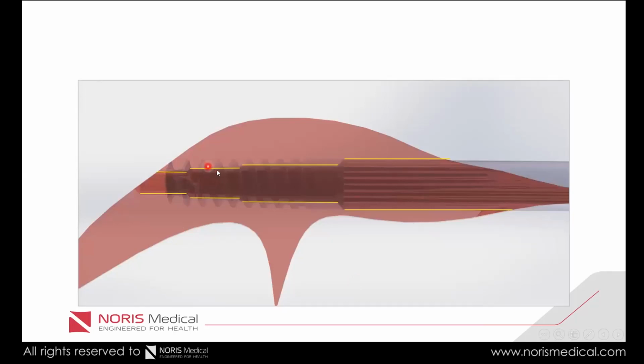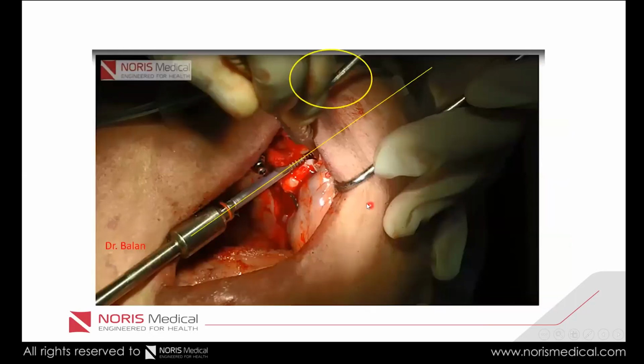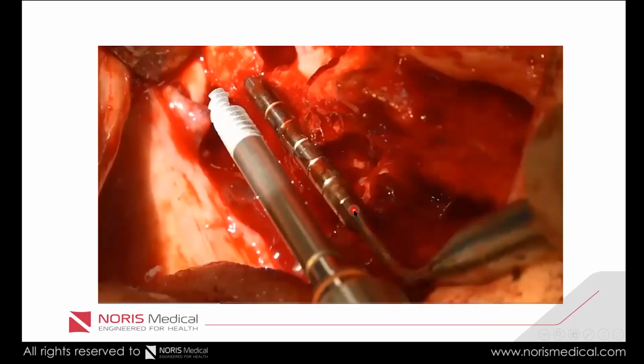And you see, this is the amount of bone this implant has condensed. That's how it looks. So we have the orbit here. This is the angle, and we actually put the implant in. Sometimes it is difficult to find the line after we have drilled it, because sometimes we fall into the sinus. So one of the ways to do that is to take the depth probe to find exactly where we are, put the implant parallel to the depth probe, and then just follow this line. Sometimes it's an easier way to do that.